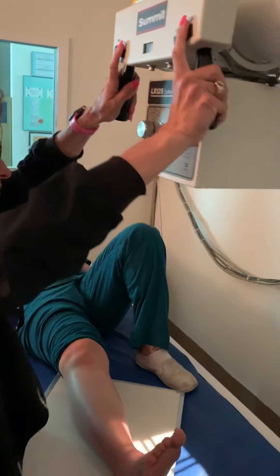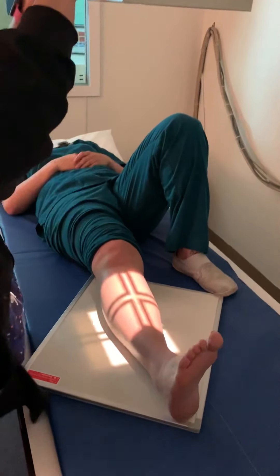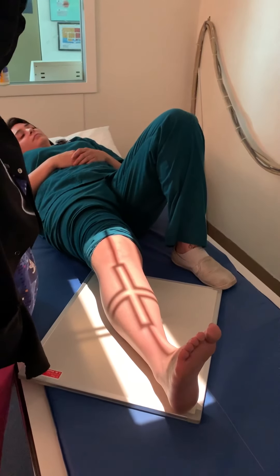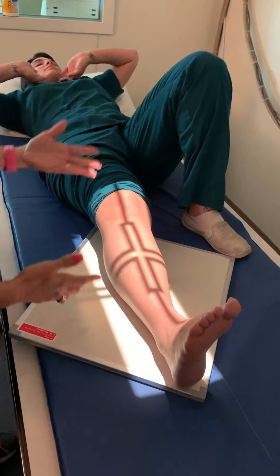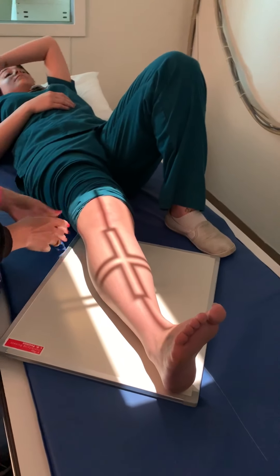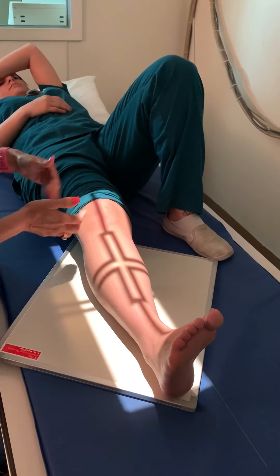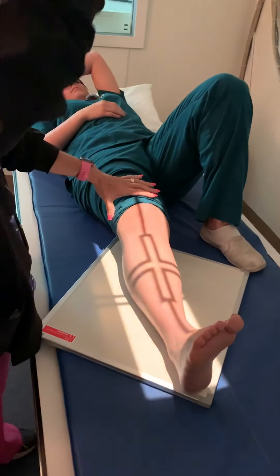We're tabletop, so I want to make sure the SID is 40 — actually, since we're diagonal, we're going to go a minimum of 44 inches tabletop so that we get less divergence of the beam to include both joints. If she were a real patient in the field, all the wrinkles and clothing would show, so I'd probably just have her change. We're at a 44-inch SID.